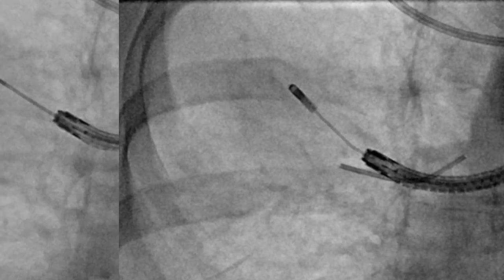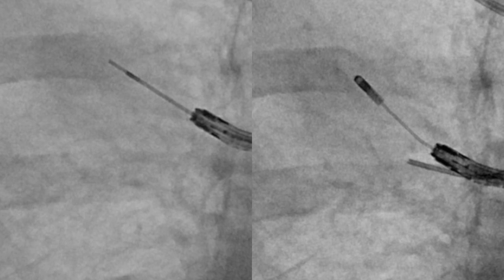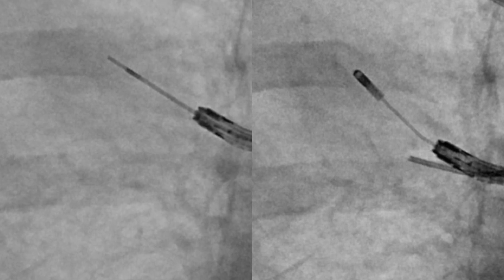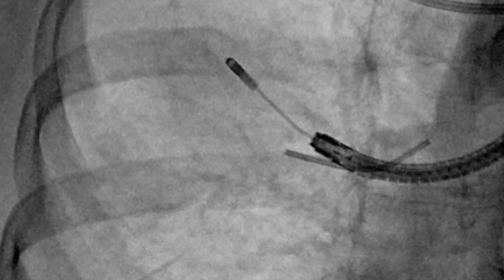As explained before, a 1.9 mm cryoprobe is advanced into the target segment via the flexible bronchoscope's working channel. Position of the tip of the cryoprobe is then confirmed using fluoroscopy while trying to create the same image as the one with the radial EBUS probe.